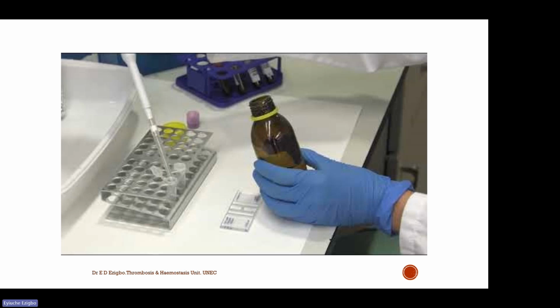Gently mix to avoid lysing the cells you want to count. You have to have patience.